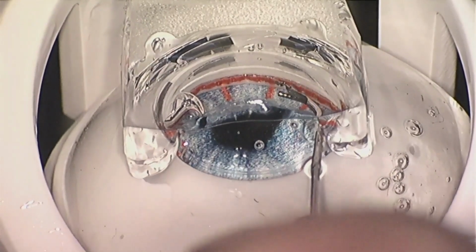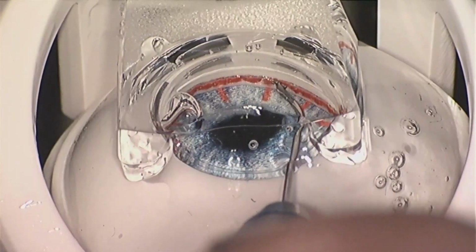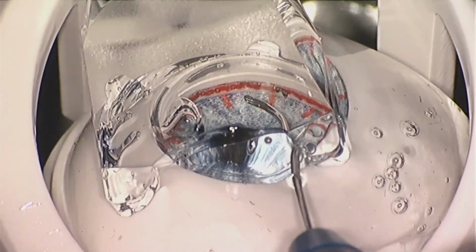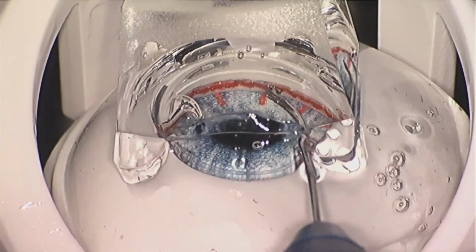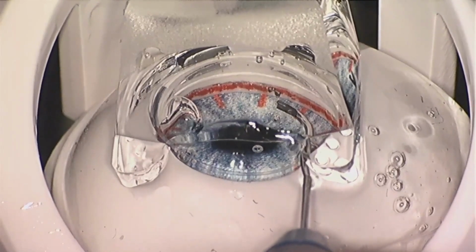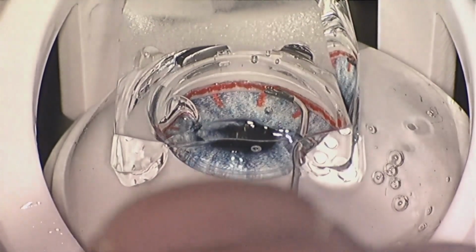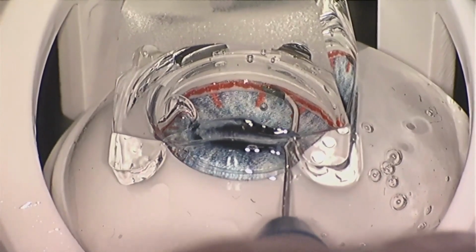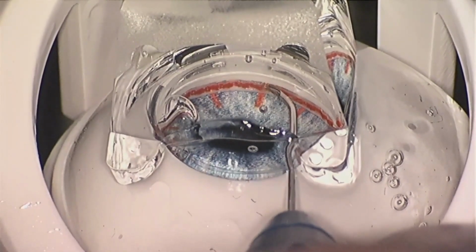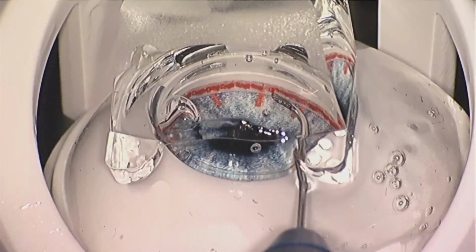It's kind of hard to see because there's quite a bit of pigment in the wet lab eye, but what I'm showing is that it's in good position, but it maybe could be advanced just a little bit. And so what you can use is the tip of the injector to actually go in the little inlet and just use a little bit of posterior pressure away from you, and then just slowly follow the curve of the eye to advance it. Now here I'm retrieving it, and so what you do is you advance the wheel all the way to open up the jaws, and then you go in a little bit further than you think, and you maintain that posterior pressure, and then just wheel everything back into you, and it'll follow the curvature of the canal.